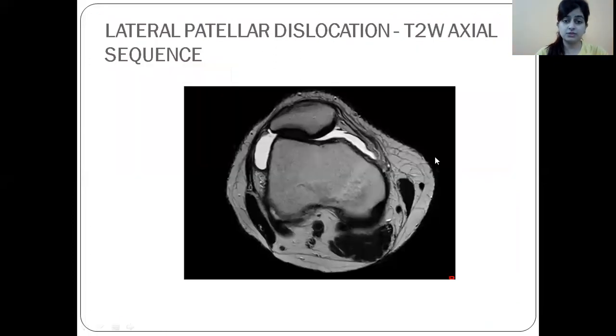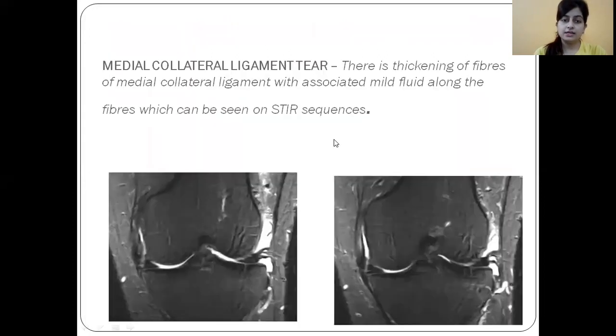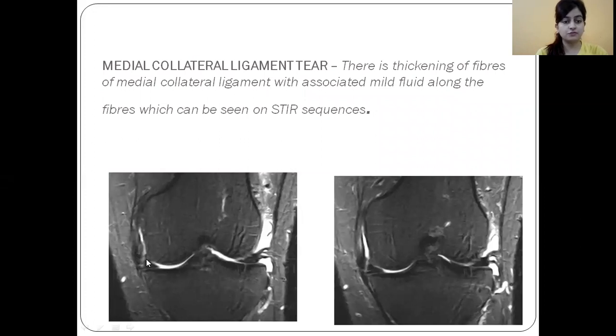In this case we can see a lateral dislocation of the patella. In this case we can see that the medial collateral ligament fibers are thickened and there is a small amount of fluid.